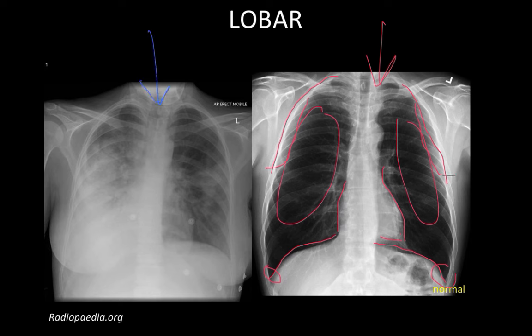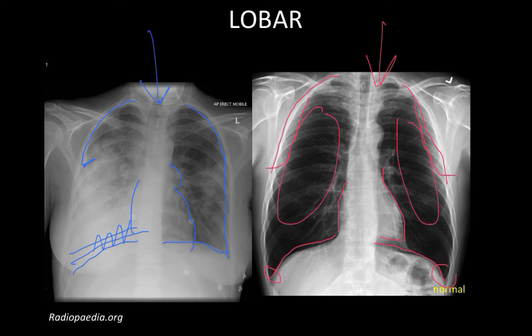This x-ray is abnormal. It has pleural margins that become hazy around the middle of the chest on the right side, and the left pleural margins are distinctly different. The heart border is sharp in the lower field but becomes hazy in the upper field, close to the aortic knob and pulmonary vasculature. On the right side, there is complete loss of the right heart border, and the diaphragm is not visible — something is obliterating that sharp margin. This is what we call the silhouette sign.